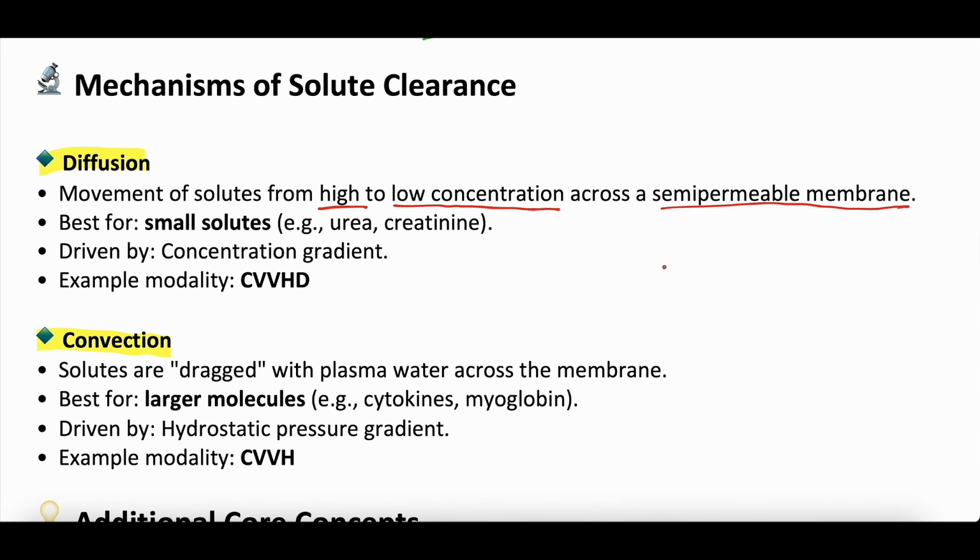And this, as we drew, and we'll draw it again, sorry for those listening, you have blood, you have a semi-permeable membrane, the filter, and you have a dialysate. And the dialysate, again, is something that we're spacing out how to spell now. Dialysate, that seems right. Apologies. The blood flows this way. The dialysate flows countercurrent, but in parallel.